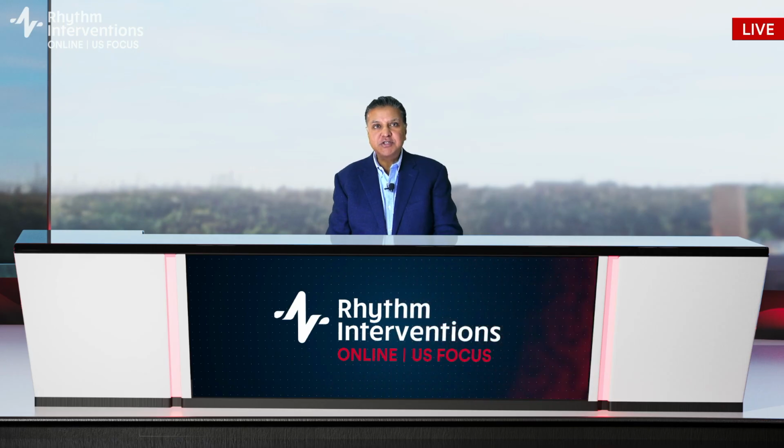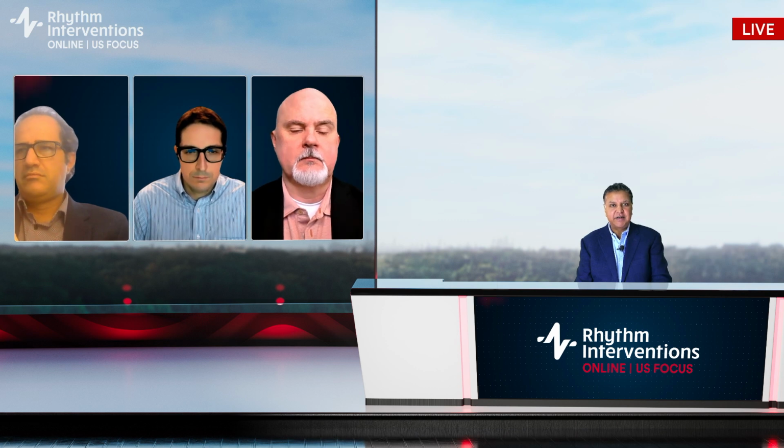Focus. I'm Suneet Mittal from the Valley Hospital in Paramus, New Jersey, and the chair for the next few sessions. In this session, the focus is RF and mapping for PAF treatment. I'm delighted to be joined today by Luigi Di Biase from Montefiore Medical Center in New York City and Pasquale Santangeli from the Cleveland Clinic.